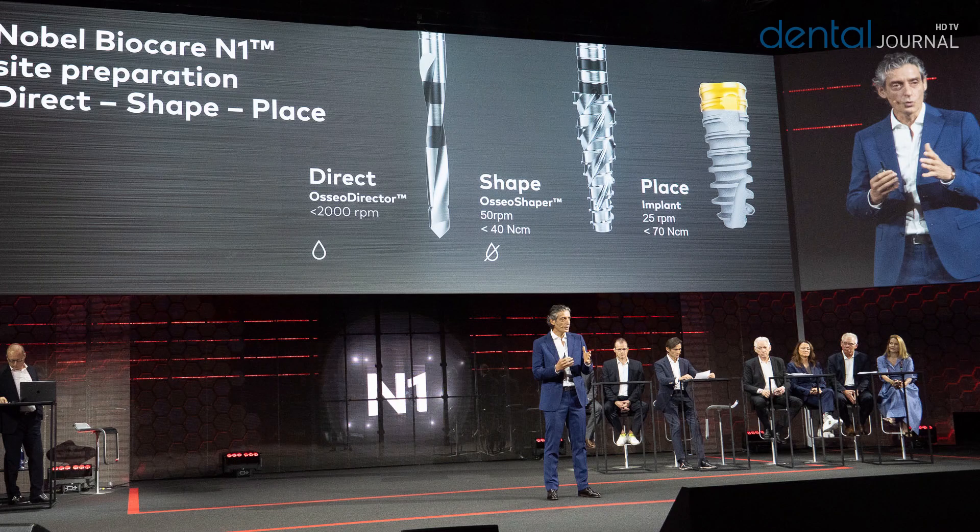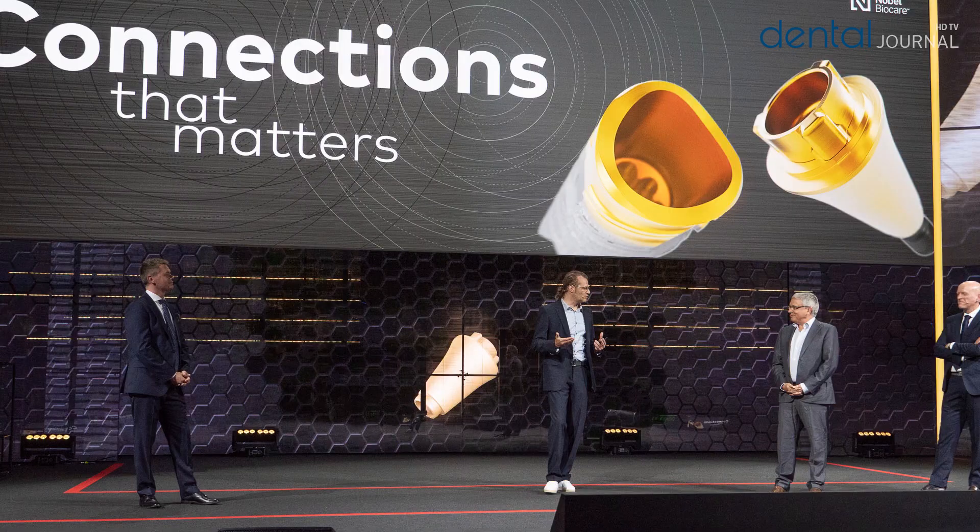Nobel Biocare just announced an all-new implant system called N1. It has some special features: one is the drilling process, but also the connection and the material are changed.